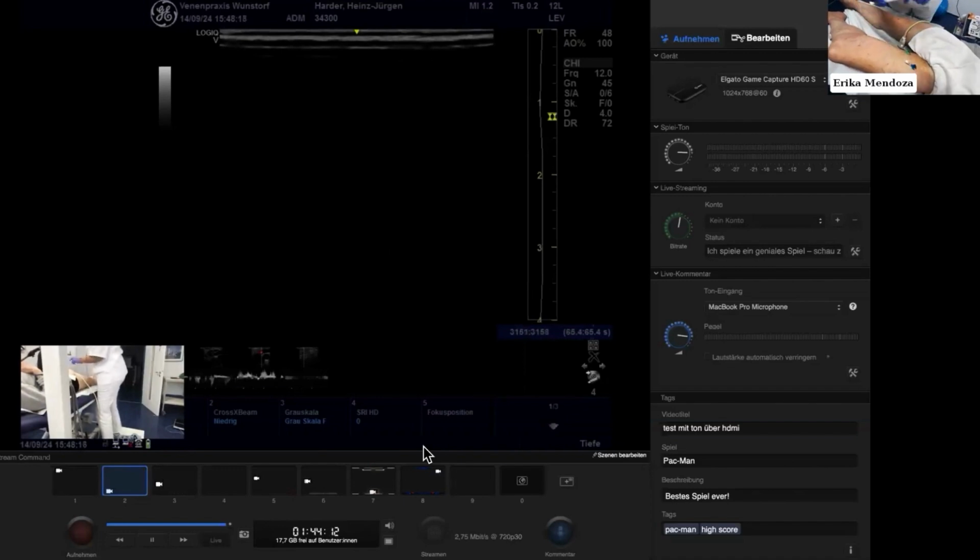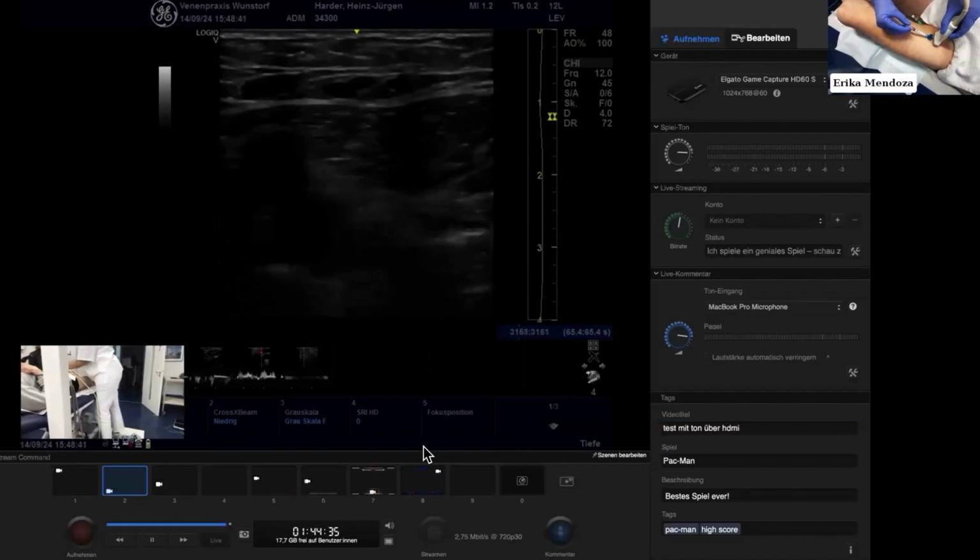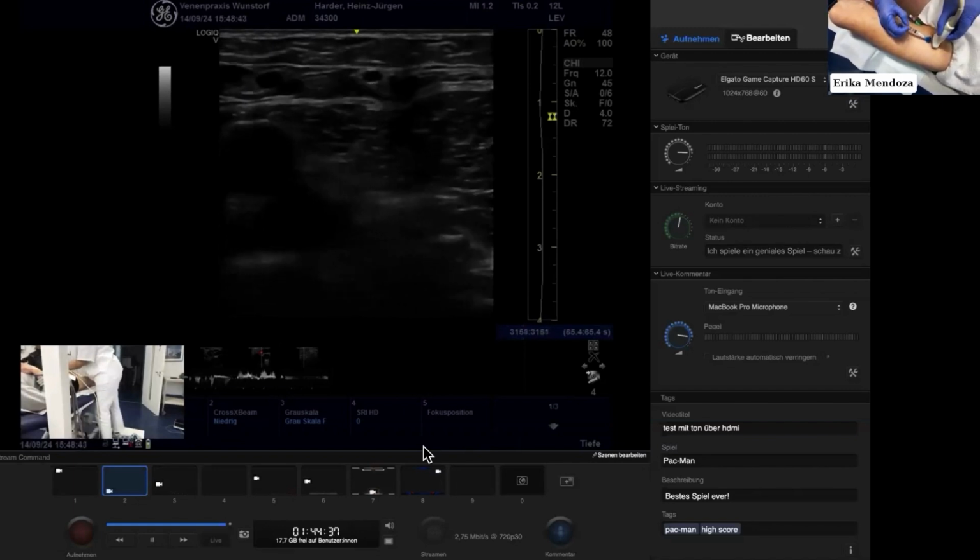if you were to inject that aneurysmal dilatation with 1, 2, 3, or 4 mils, let me tell you, all of that is going straight into the deep system and then across the right to left shunts, and it's not worth the risk for the patient. Yeah, absolutely. It minimizes the amount of foam dramatically. Precisely. We will see what happens if it's intraluminal or not.